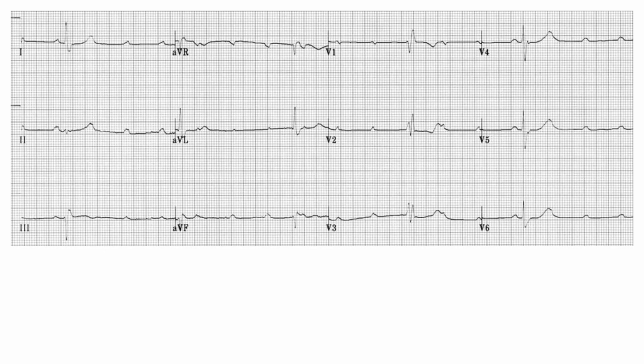So in this ECG, you can see there is an RSR' pattern here. This is RBBB. Then you look at the axis. Lead 1 is positive. Lead AVF is negative. So that means it's a left axis deviation. So plus left axis deviation, that means left anterior fascicular block. Plus, is there any evidence of AV block? Yes. So you may not be able to understand now.